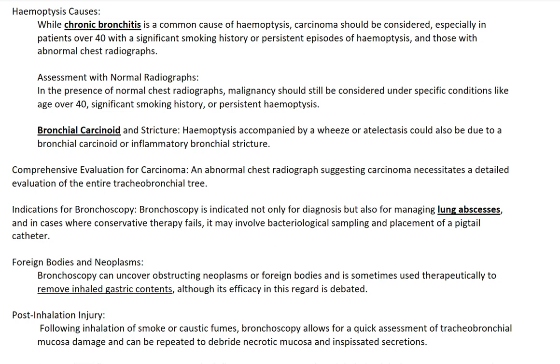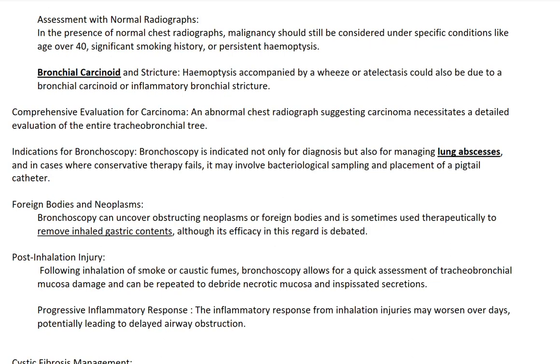9. Indications for bronchoscopy. Bronchoscopy is indicated not only for diagnosis, but also for managing lung abscesses, and in cases where conservative therapy fails, it may involve bacteriological sampling and placement of a pigtail catheter. 10. Foreign bodies and neoplasms. Bronchoscopy can uncover obstructing neoplasms or foreign bodies and is sometimes used therapeutically to remove inhaled gastric contents, although its efficacy in this regard is debated.